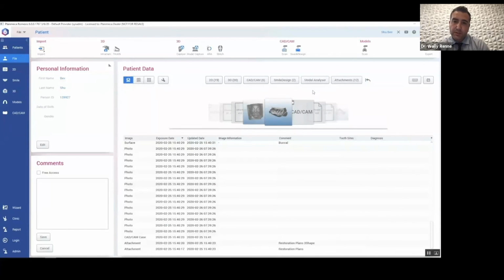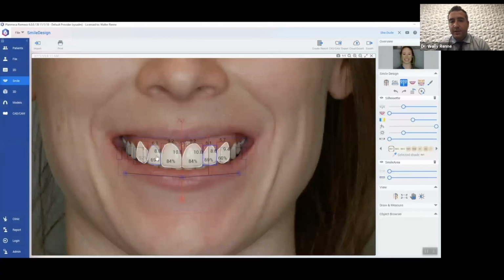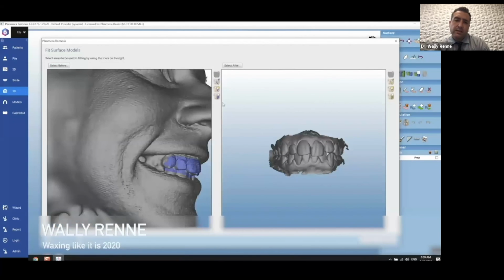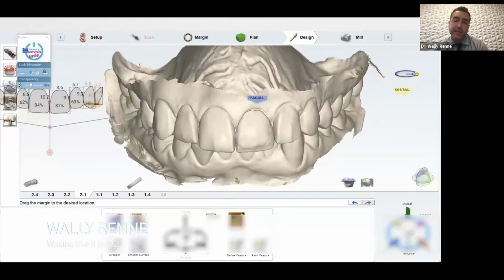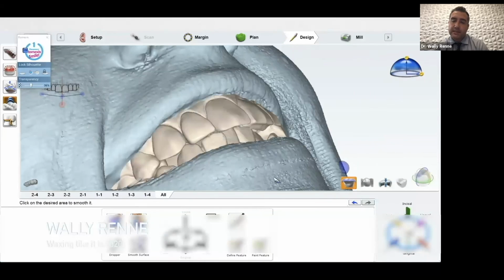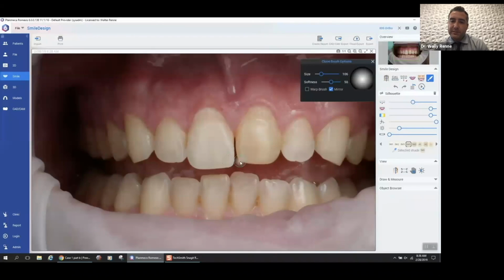And so it's a good verification that the patient definitely needs an occlusal guard or something like that, or some restorative work. Smile Design and 3D face scans, merging intraoral scans with 3D face scans. This is the digital playground if you want to go high tech in your office. The sky is kind of the limit on what you could do, and it's only limited by your imagination.